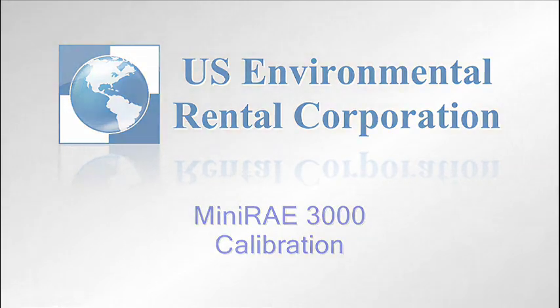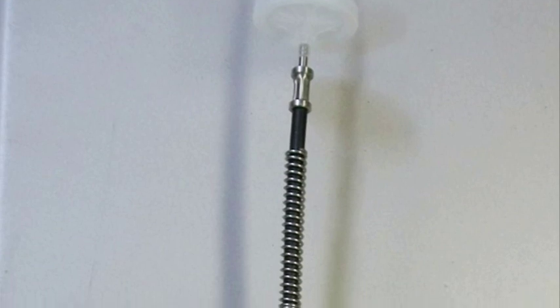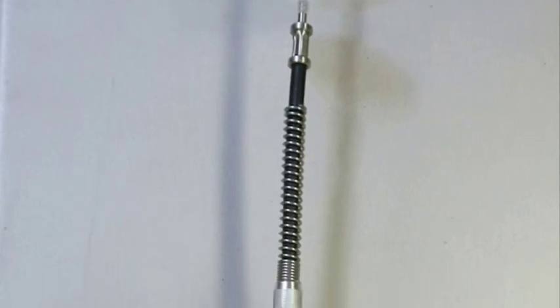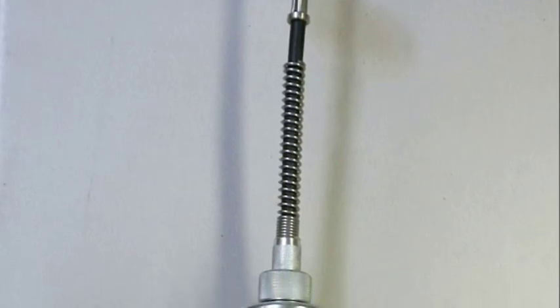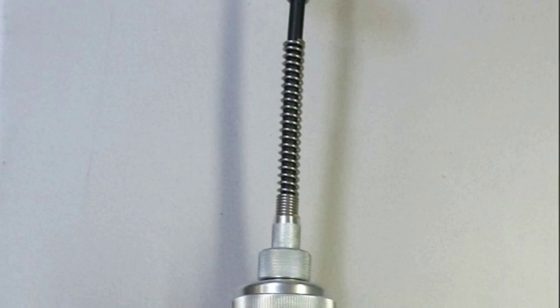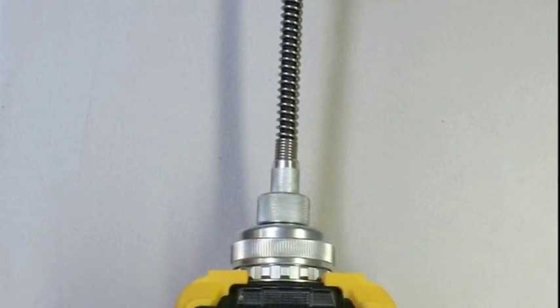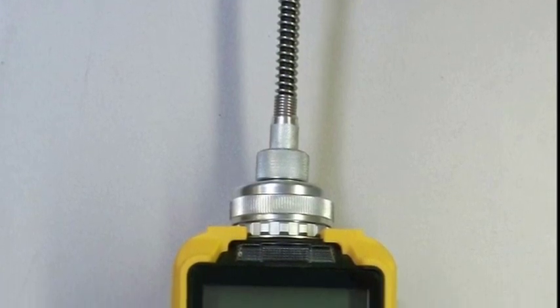In this video, we will calibrate a MiniRay 3000 photoionization detector. Photoionization is the process by which an ultraviolet lamp ionizes volatile organic compounds. The ionized gas then passes over a sensor which detects the charge and converts that signal into a current, which is then amplified and displayed on the unit as a reading in parts per million.